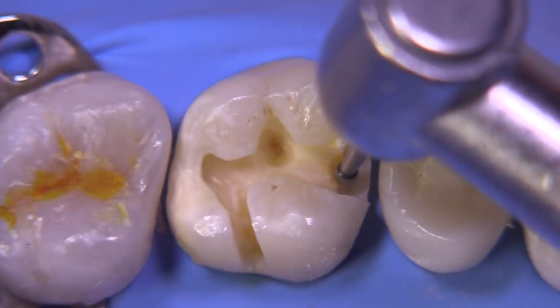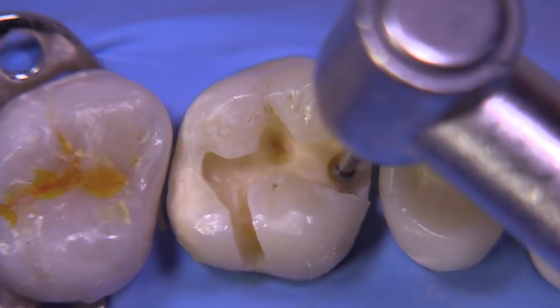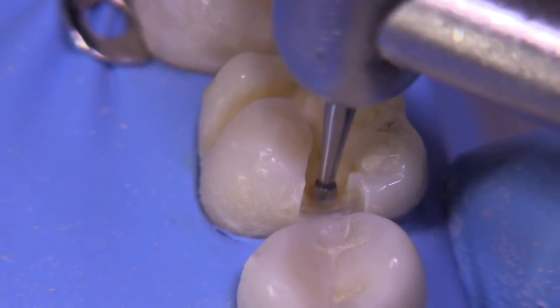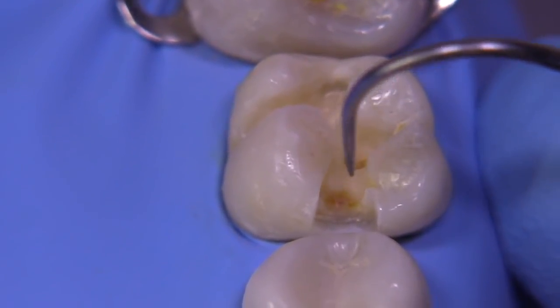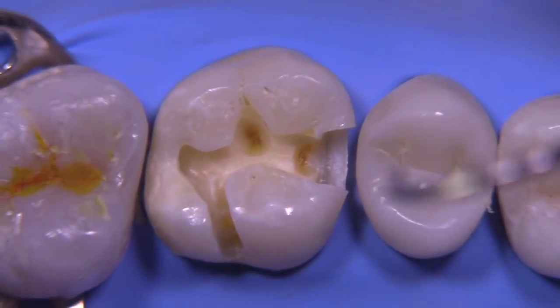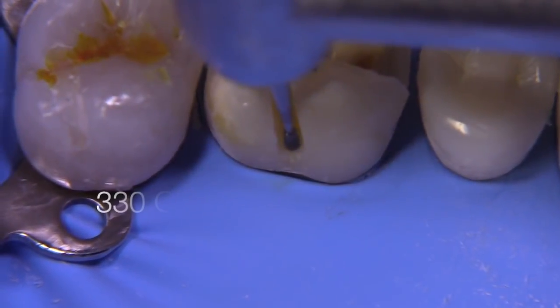When you see it scraping up little pieces of caries like that, you know you have a little bit more to go. We also have a lesion on the mesial at the axial pulpal area and we're going to do this the same way. Slow speed is critical — or an electric handpiece dialed down very slow, like 500 to 1000 RPM. The key is that you want to feel what you're doing, get a sense of the hardness of the surface. If you scrape across the mesial and see those little chips coming out, that is an indication that caries is still remaining. Now you could leave that caries — we know from numerous studies that leaving caries at that level can be arrested quite nicely — but I went ahead and removed a little bit more just to demonstrate the caries removal process more aggressively. You can do it either way.